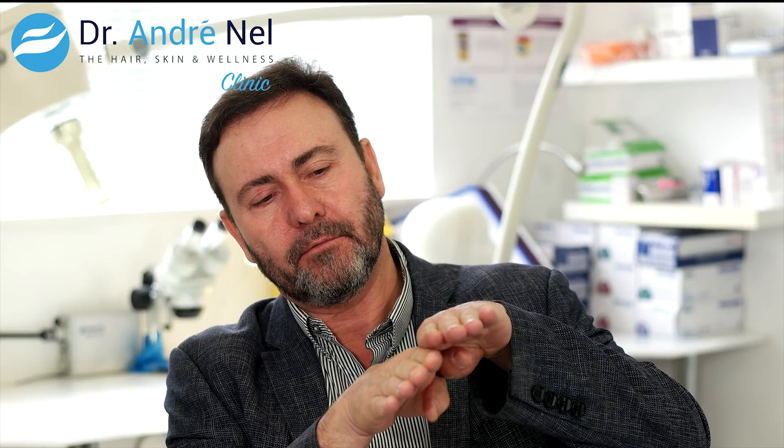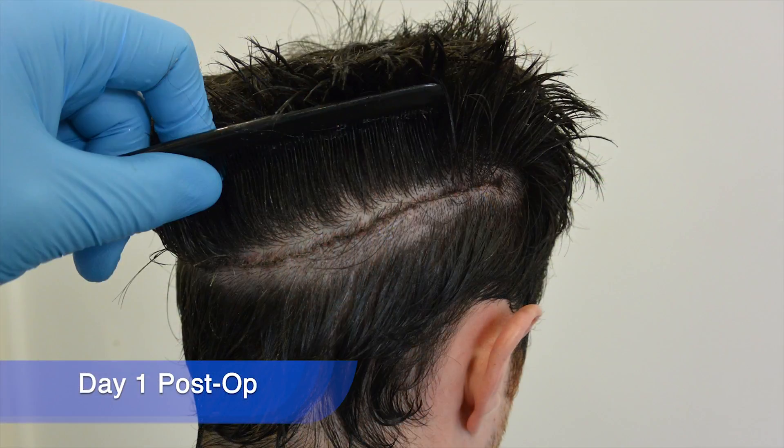We're going to say a few words about a trichophytic closure when we do a strip harvest. That is a method where we bevel the lower edge of the wound once we've taken out the strip, and as we close it the upper section of the flap is slightly overlapping the lower section, so the lower section fits in underneath the upper section.